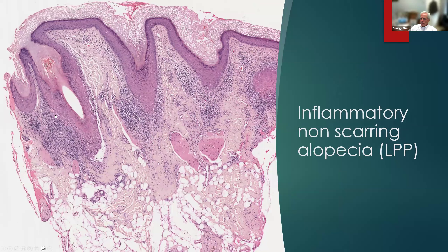Here's a case of early lichen planopilaris. We just have perifollicular inflammation at the level of the isthmus and destruction of the sebaceous glands, but we still have one, two, three, four, maybe five follicles in this biopsy. So they're on their way to being destroyed but haven't been completely destroyed yet — and so this can be confusing.